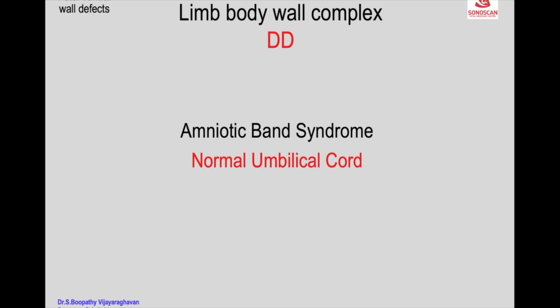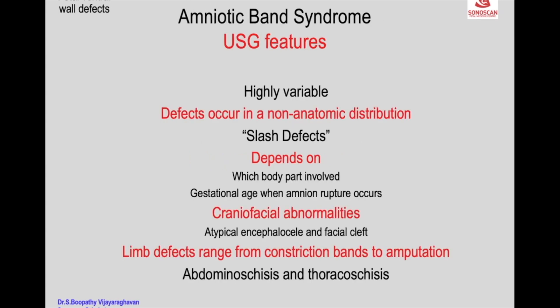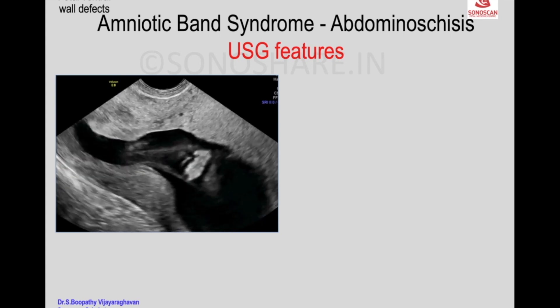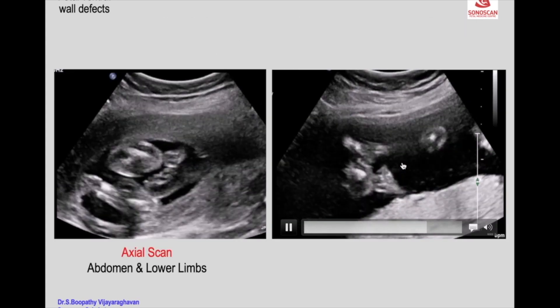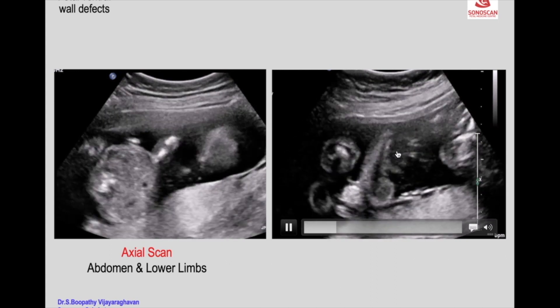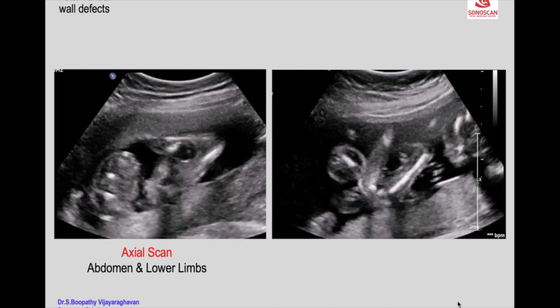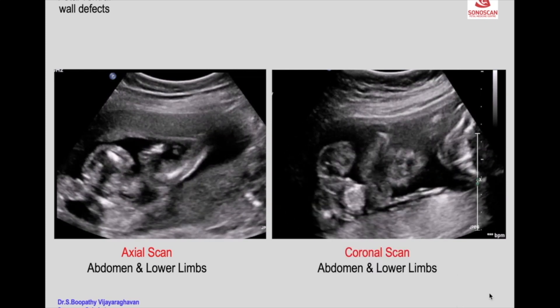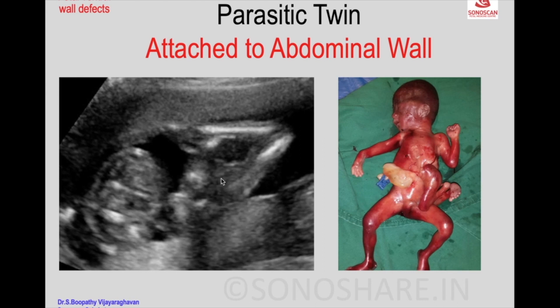The differential diagnosis includes amniotic band syndrome, thoracoschisis, and abdominoschisis when the defect involves the abdominal or thoracic wall. Here is a case where four femurs are seen — two from the fetus and two extra — attached to the abdominal wall. This is a rare condition of a parasitic twin with part of the parasitic twin attached to the abdominal wall.